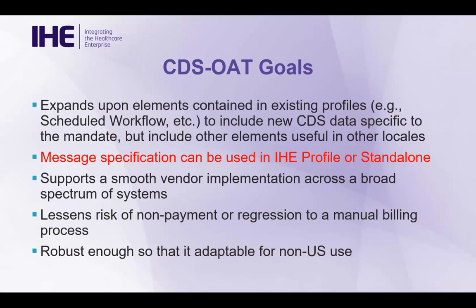But other systems, for example an EMR that needs to convey the CDS information down or receive that information, can also use the message specification defined in section 6.4 as a standalone message specification, because that is the core part of CDSOAT.